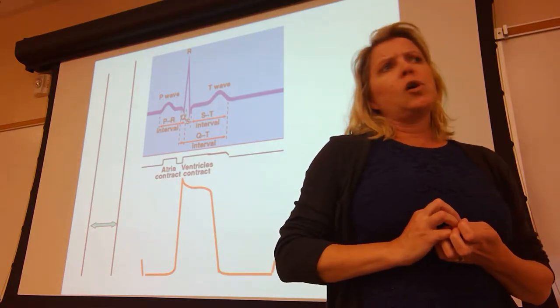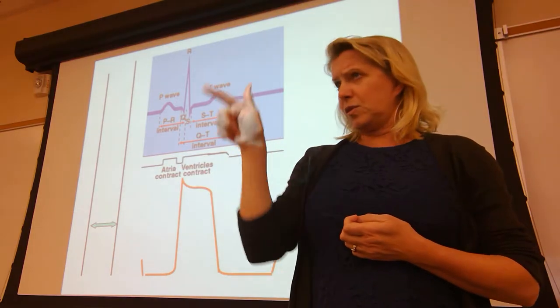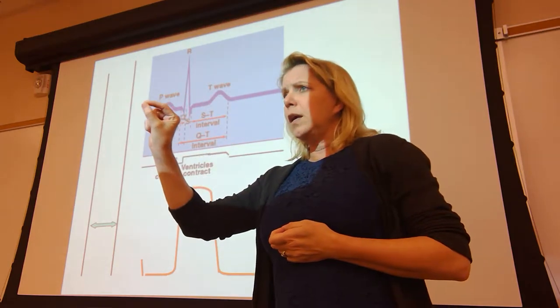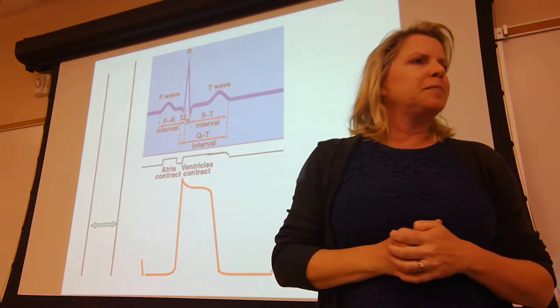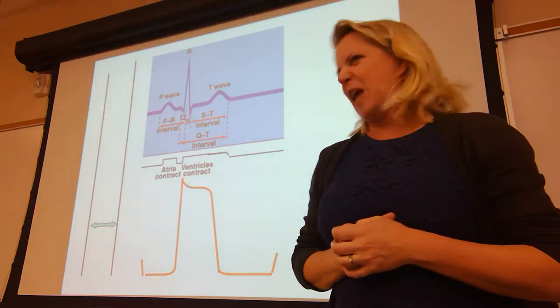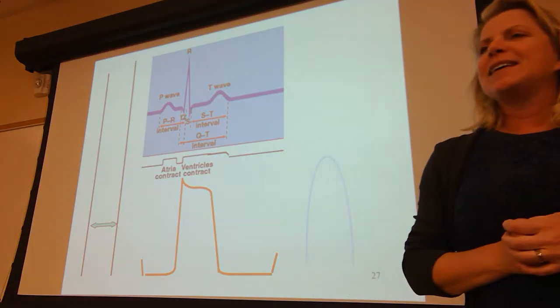But please don't be that nurse when you see on the EKG screen, please don't be that nurse going, it's just perpendicular vectors. Just give it a moment. It'll be fine. Probably not fine. Do something, please.